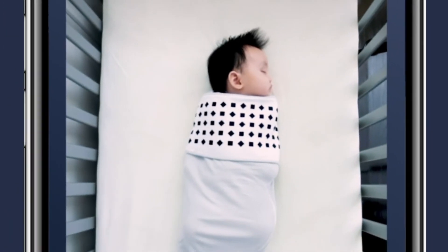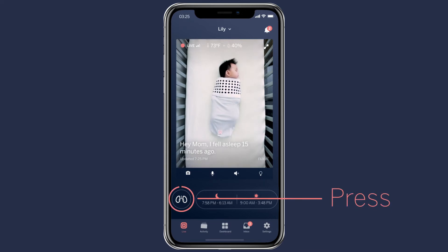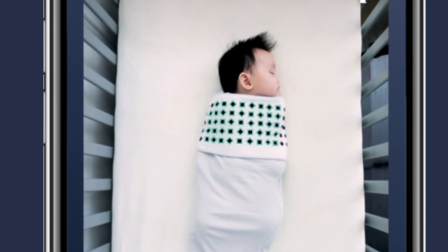Whichever product you choose, ensure your baby is wrapped with a snug fit. Then, open your Nanit app and press the lungs icon to begin the breathing motion monitoring session. Nanit continually monitors the pattern as it moves with your baby's breathing motion and sends this information in real time to your smartphone.